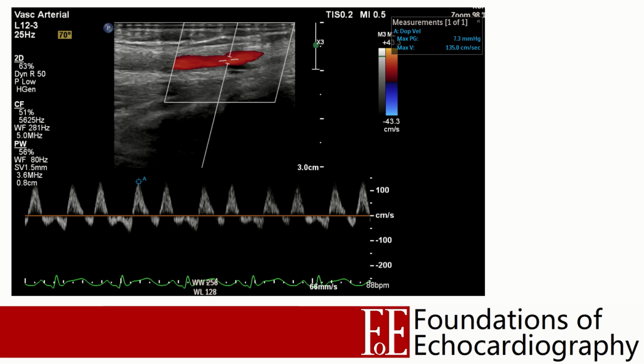This technique is acceptable in vascular ultrasound, where the blood flow tends to be laminar and the blood is moving along a single known plane through a vessel with parallel walls. The same cannot be said for flow within the more geometrically complex heart, and therefore angle correction is not applied in echocardiography.